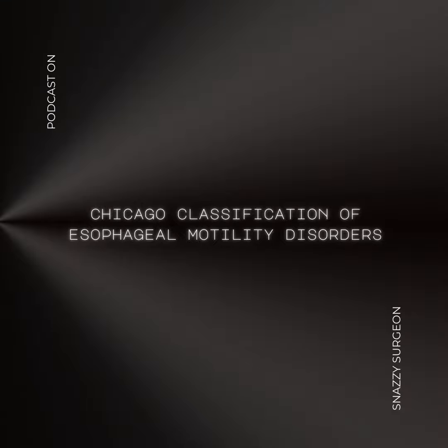So tell me, what specific information do these esophageal motility studies, interpreted through the Chicago classification, give us that's particularly useful when we're considering surgery? Well, for one, it lets us really scrutinize the strength and coordination of those esophageal contractions. Are they strong enough to actually move food along? Are they happening in the right order in a nice coordinated sequence? Figuring out the specific motility disorder helps us understand what's going wrong functionally. And it also helps us assess the LES, the lower esophageal sphincter. Is it relaxing the way it should when the patient swallows? Is it too tight, too loose? These are all critical things we need to know before we even think about going to the OR.